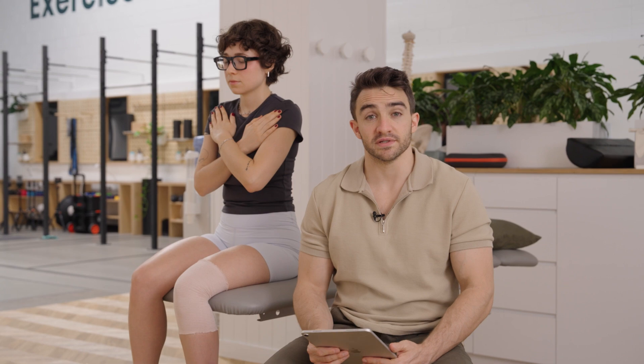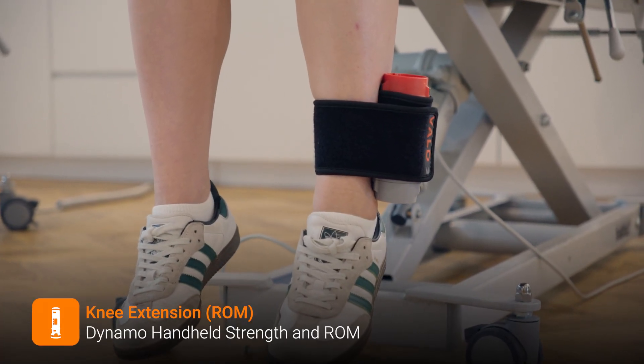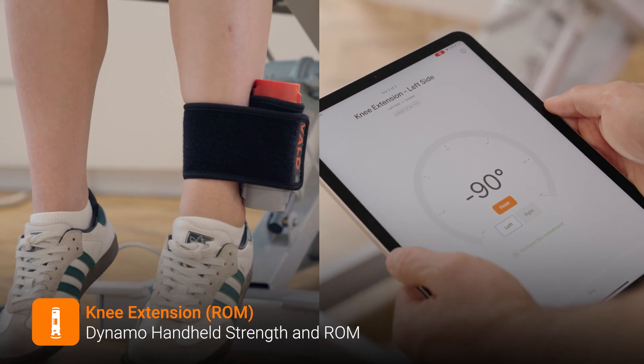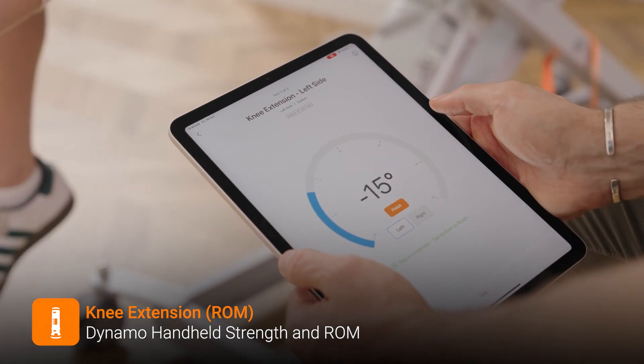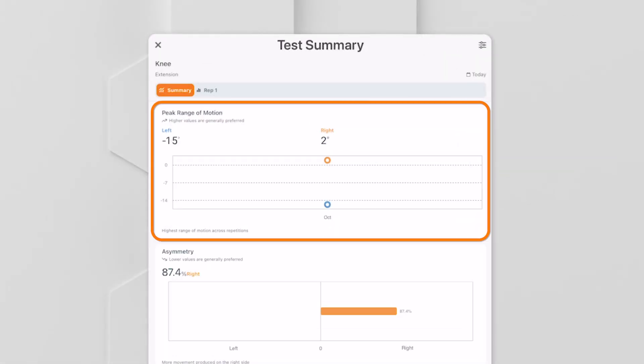First we use the Dynamo to track Louisa's knee range and quad strength. On my mark, Louisa starts to straighten — nice and slow — then relaxes back down. Her injured leg still experiences a bit of a discrepancy in range of motion, but now let's look at her strength.